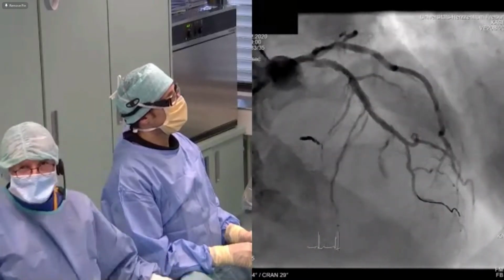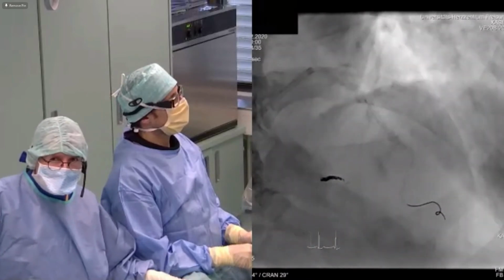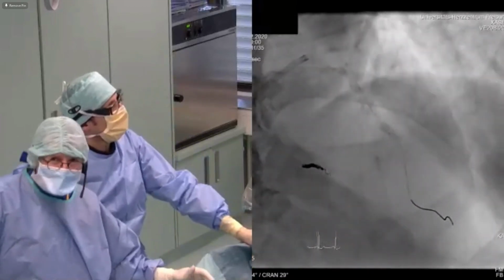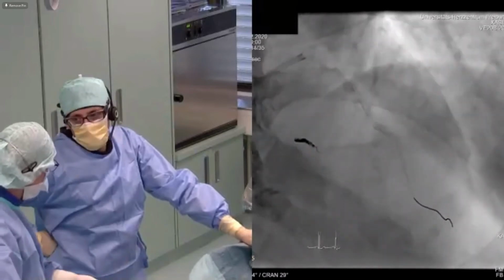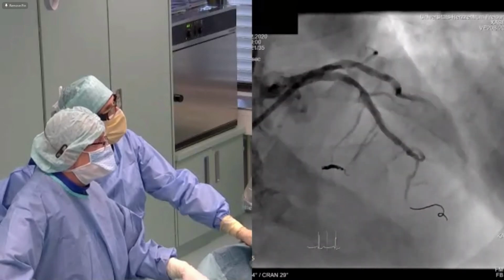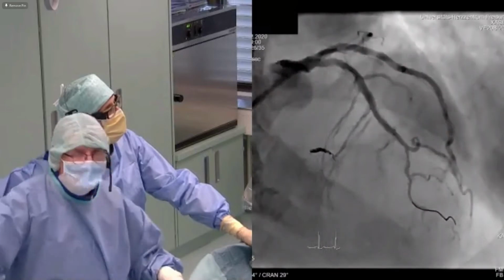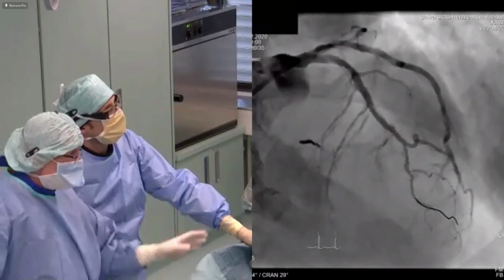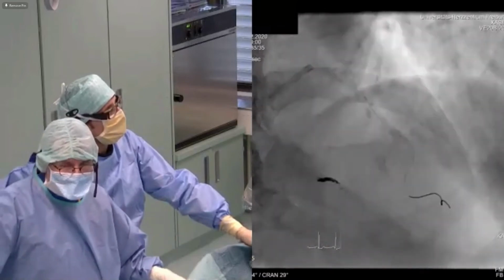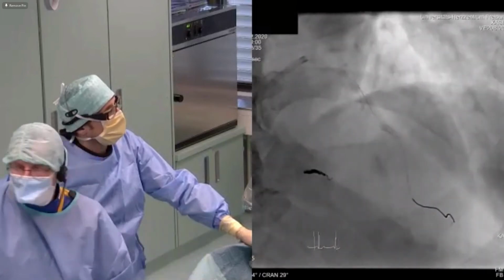38. The question is which kind of stent should we take? Something which has really very good radial force, like Synergy, Megatron, or Onyx stent. So this will be our first choice. Probably 3.0 Onyx here, and then go with 3.5 proximal for post-dilatation. But then we need 38. Yes. So okay, we decide now to take Onyx 3.0, 38 millimeters, and we will go ahead proximal with 3.5 high pressure post-dilatation. And we always have the option to check this in OCT.